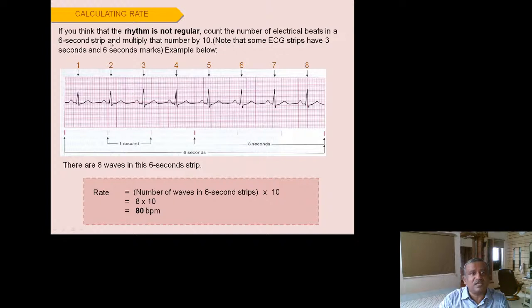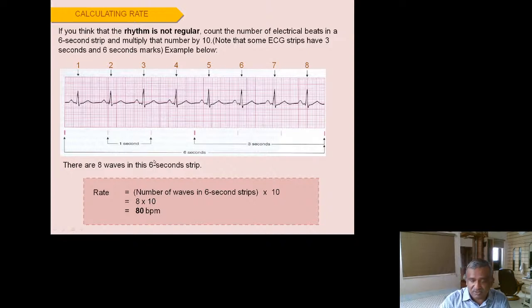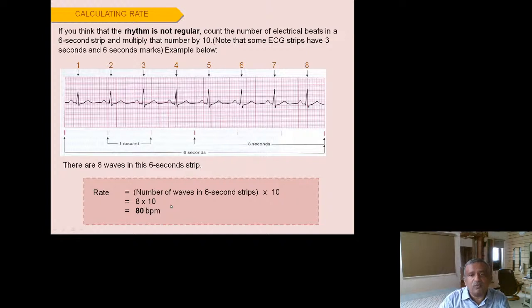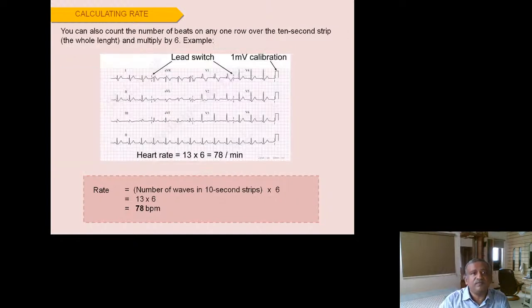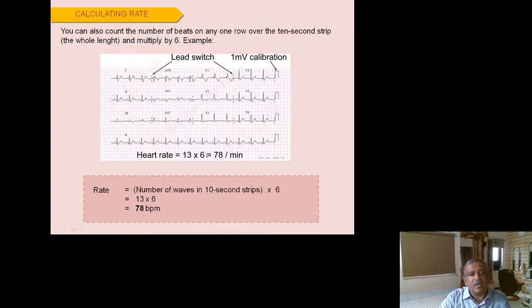If the rhythm is regular and you have a 6-second computerized strip, count the number of QRS complexes and multiply by 10. For example, 8 QRS complexes in 6 seconds gives 80 beats per minute. Alternatively, count beats in a 10-second strip and multiply by 6 to get the per-minute heart rate. All these methods yield the same result.